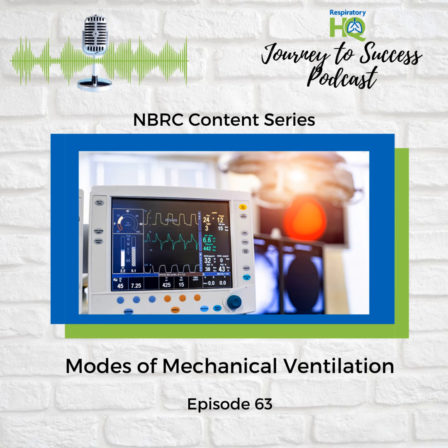So are there any downsides to taking away that much control from the patient? There can be. For many, being on controlled ventilation is a very uncomfortable experience. It can feel like you're fighting against the machine, which increases the work of breathing. So a patient on controlled ventilation often needs sedation, and in some cases even paralysis, to ensure they're comfortable and not fighting the ventilator. That makes sense. From a clinical perspective, if you're going to completely take over someone's breathing, you want to make sure it's not creating more distress. So controlled ventilation is a pretty heavy-duty intervention.